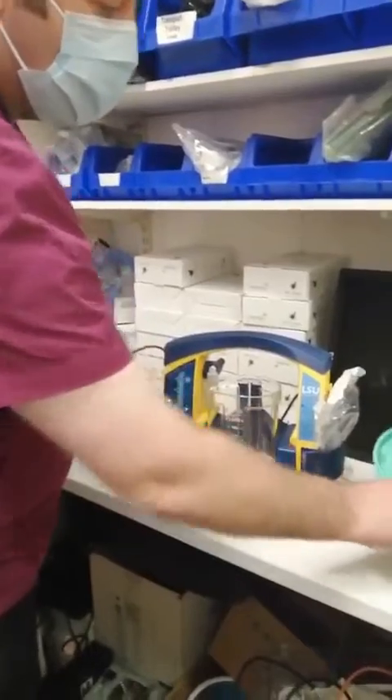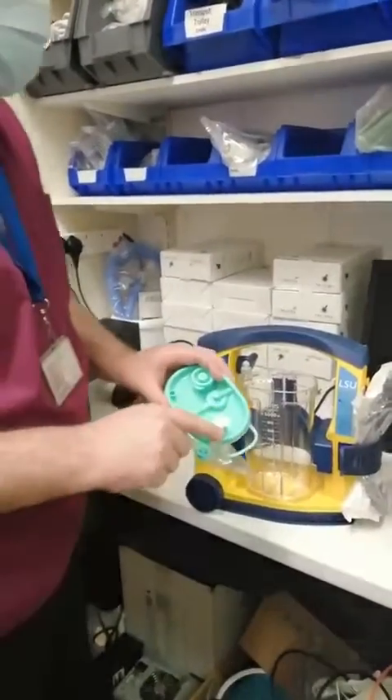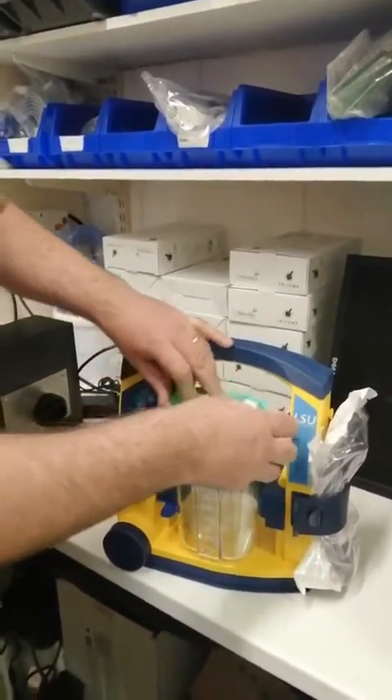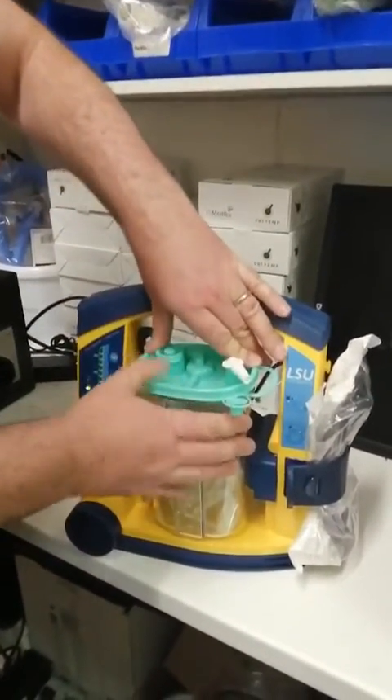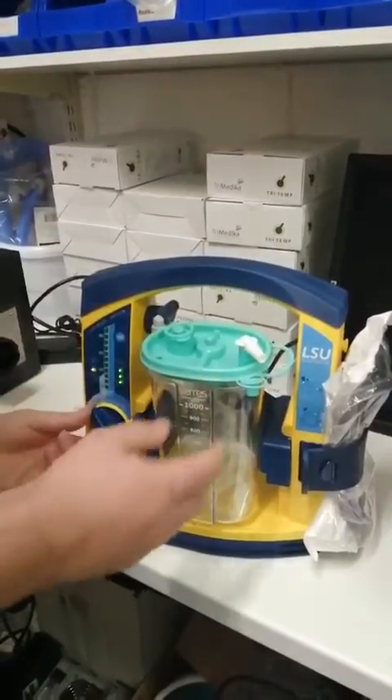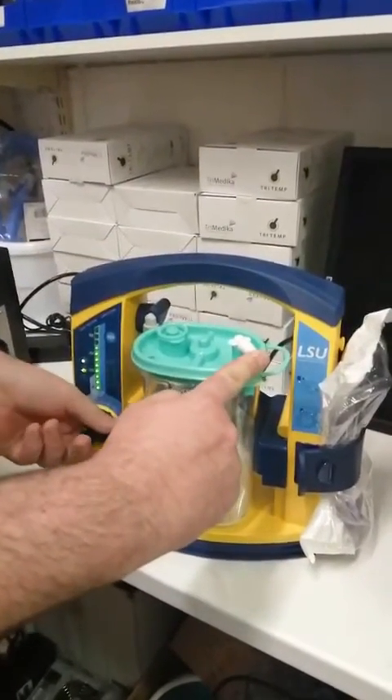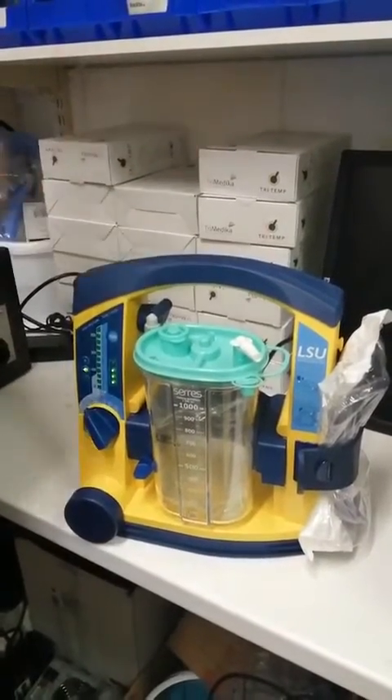You get your new liner, which comes attached with a connector. You place it into the canister, and when you reattach the liner, always ensure to turn on the machine to confirm that you have suction and that it is working. Then turn it back off and it's installed.